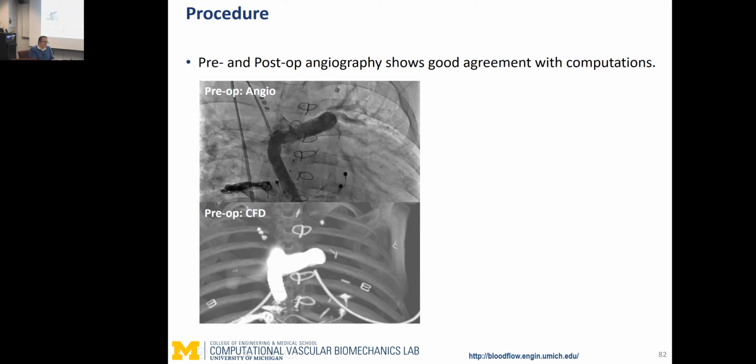So this is the preoperative angio. This is the catheter. They release the dye on this vessel that we're trying to investigate, and you see a massive bias to the left lung of the patient, to your right. You almost don't see any contrast here. In our software efforts, we always try to draw things as close to what they are used to seeing, but this is basically a visualization of particle residence time. Whatever you see with lots of particles, the contrast is going to look more intense. And we already knew, based on the simulation that I showed you, that was the case.